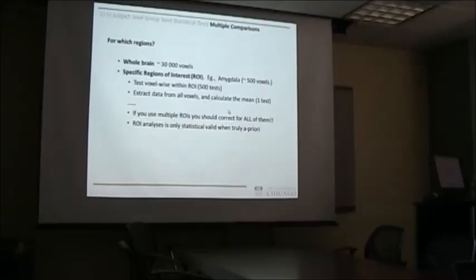Downside is if you would do this, suppose one part of the amygdala responds a little bit differently than another part of the amygdala, and you take the mean, right? You might average out any effect. So it's difficult to say what is the best. It really depends on the situation. I guess usually people just do all and see what comes out. That's the way it is.